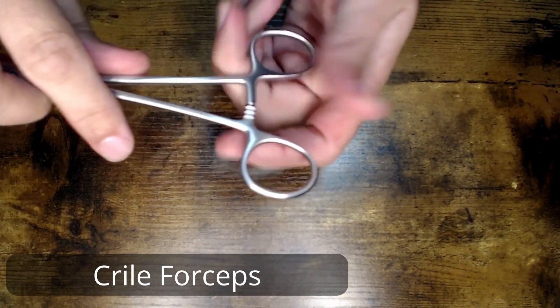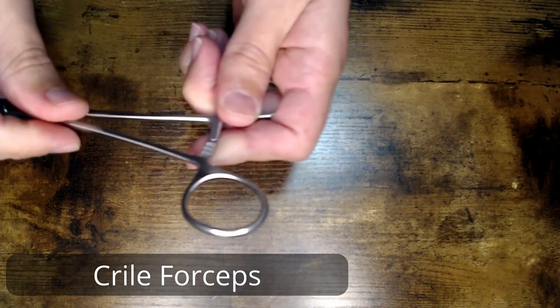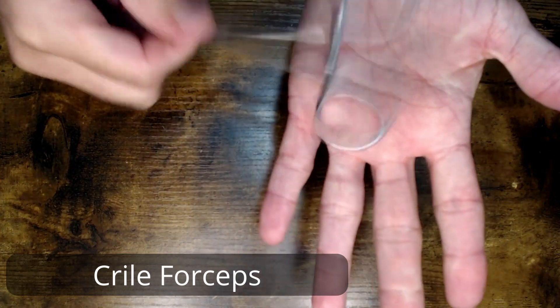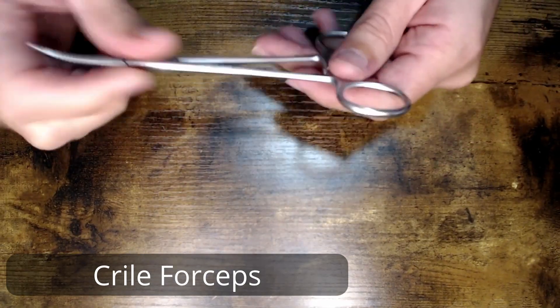Coming down to your ring handles — you see that little ratchet there. Always want to test your ratchet to make sure that it's locking and it's not loose once it locks. You can do the palm test, you can also do the table test — a slight tap to make sure that that ratchet does not pop open.